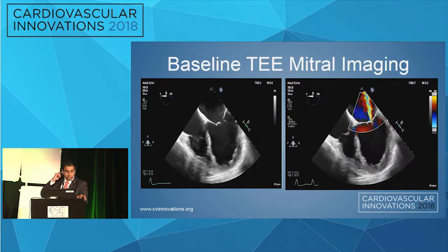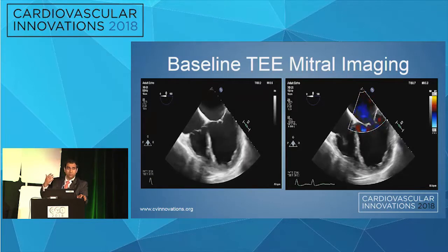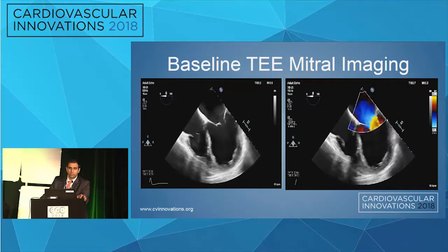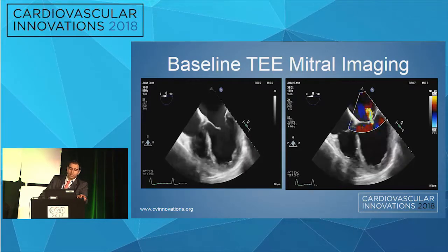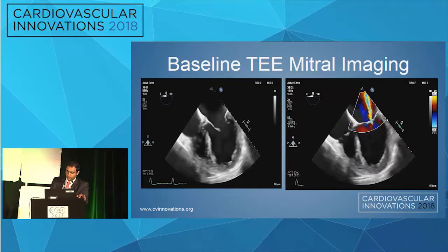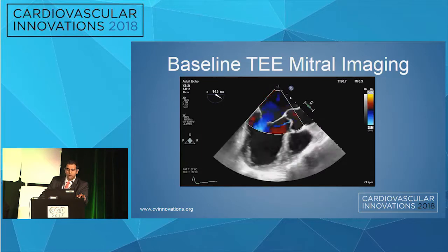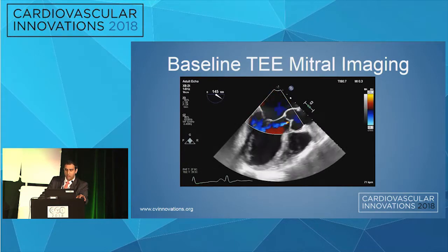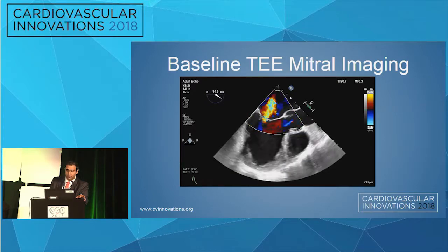Baseline TE imaging. I'm going to go through the mitral clip portion very quickly because I just want to highlight where the transseptal was done since it'll be relevant to the LAA closure portion of this presentation. You can see it's a fairly central mitral regurgitation jet, A2, P2. There's some thickening of the leaflets. You can even see in the image on the left that there's a little bit of a torn cord element there. So we felt that this was a mixed etiology MR, albeit he has a severely reduced EF, but we felt that this was a clippable case. He's got some trace AI.